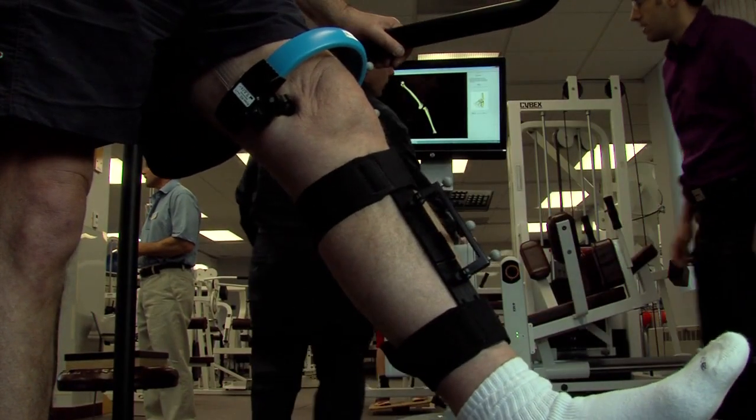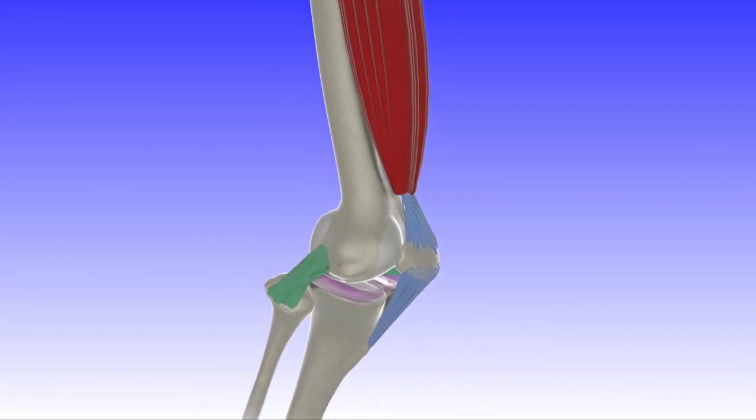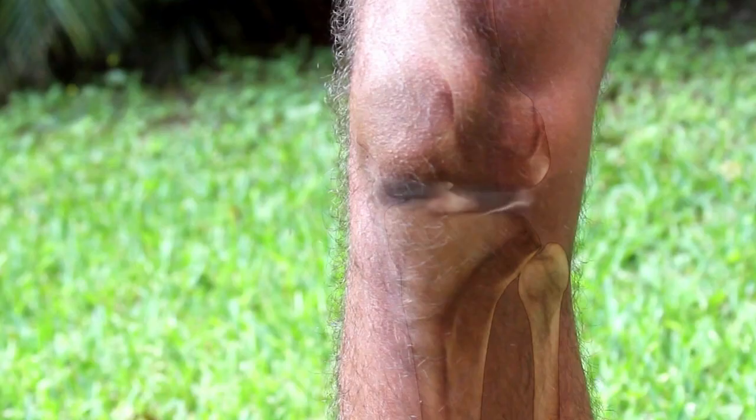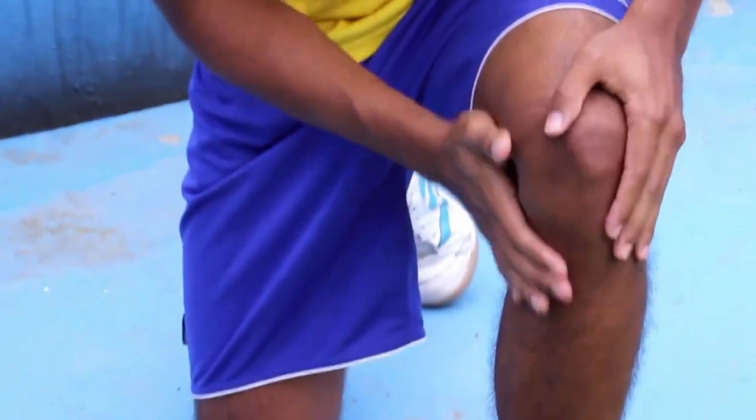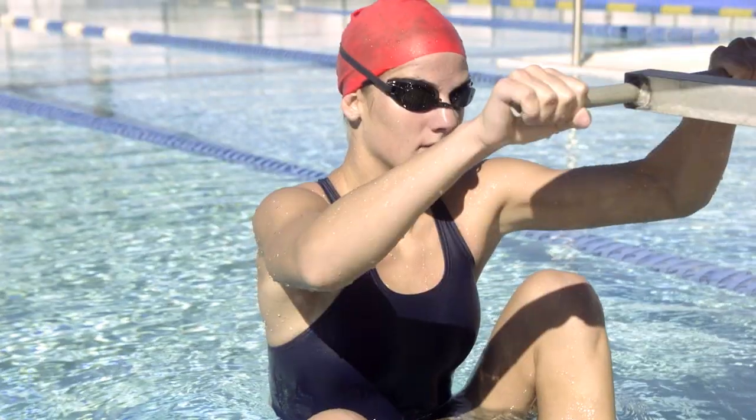It moves back and forth, but it really does more than that. Not only is it a hinge, but it rotates as you walk and move it, and it also goes backwards and forwards. So that makes for issues when you treat the knee joint because there are these 3 planes of motion and they're all interrelated. Knee injury, disease, or other pathology that results in pain and abnormal function of the knee can reduce a patient's quality of life, ability to work, and performance in sports.